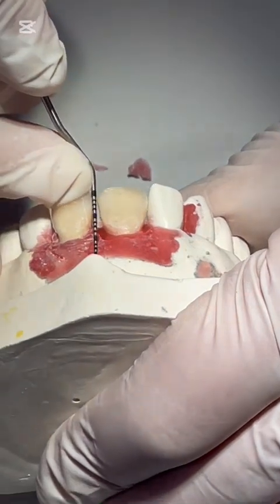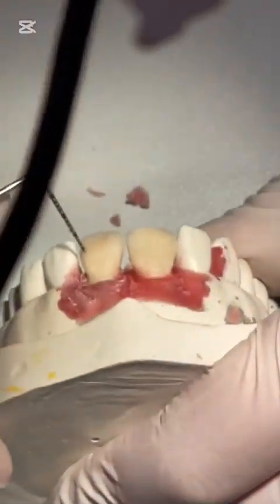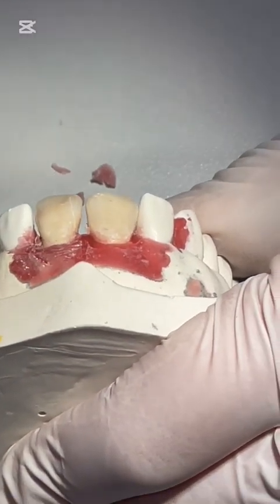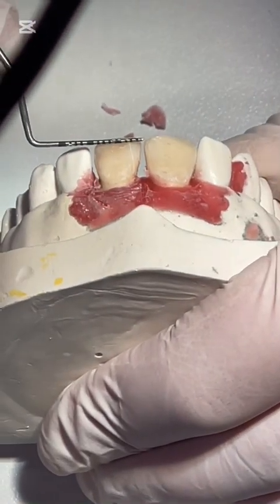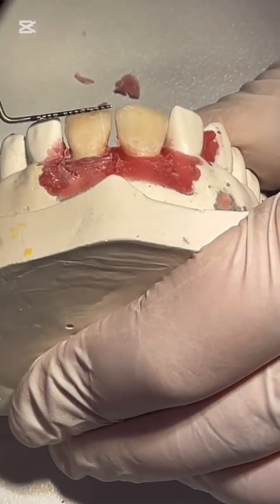So if I want to make the left central incisor similar to the right one, I have to increase the width. Here we said the width is 8, but here it is 11. So I should add 3 millimeters more, 1 millimeter from the mesial and 2 millimeters from the distal, right?